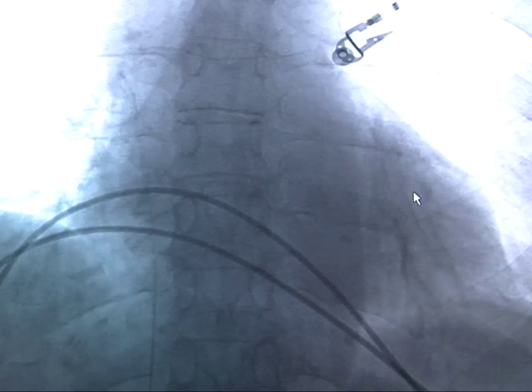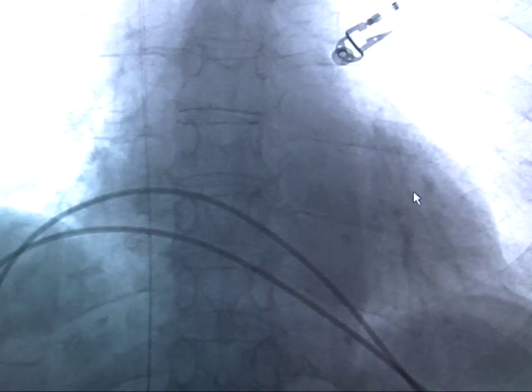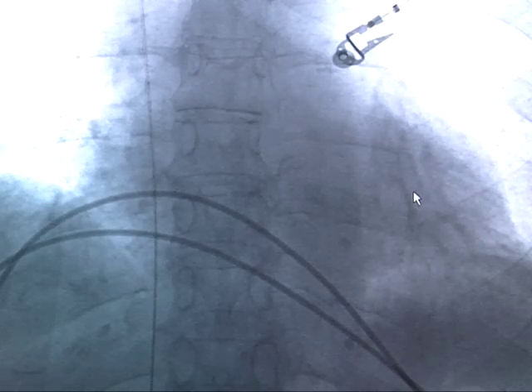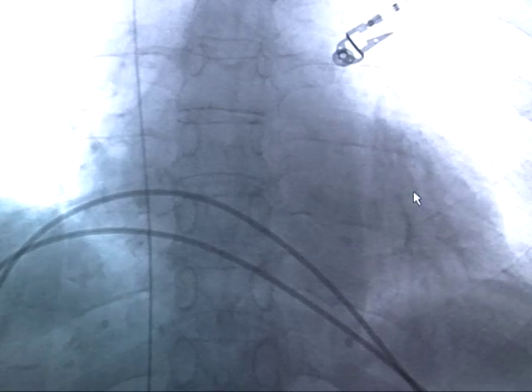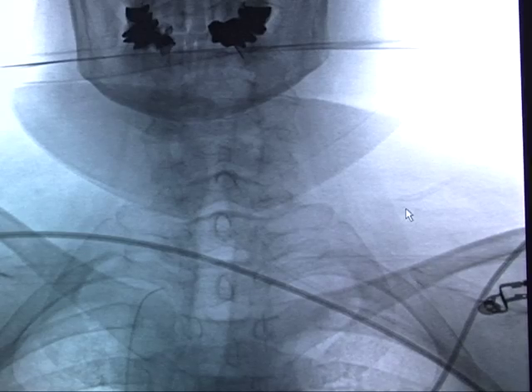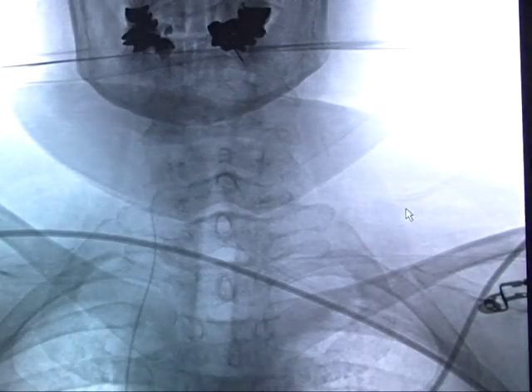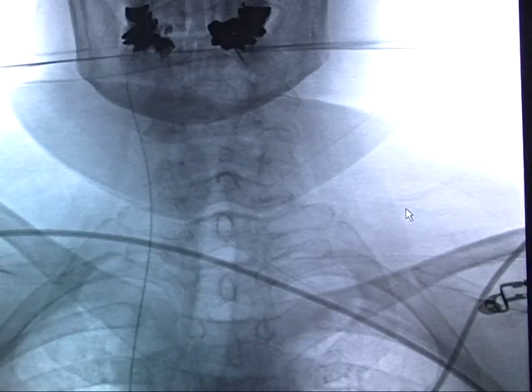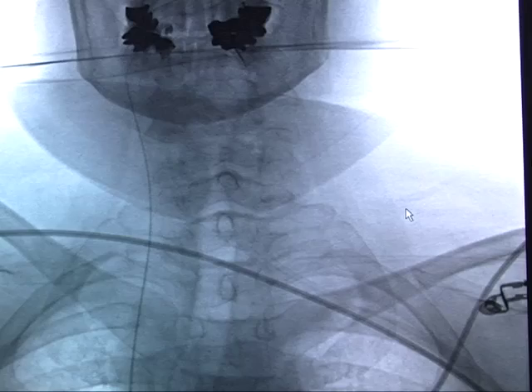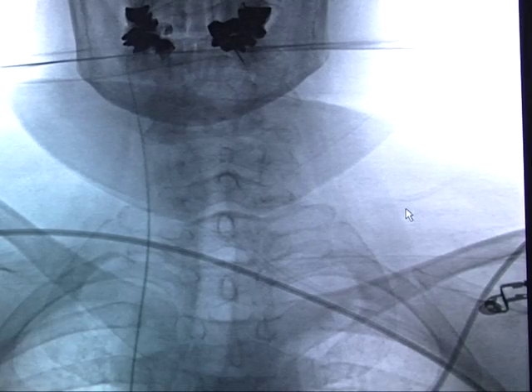An AP view showing a wire being advanced into the inferior vena cava, into the superior vena cava. This wire will then be manipulated into the internal jugular vein on the right side. A catheter is advanced over the wire.